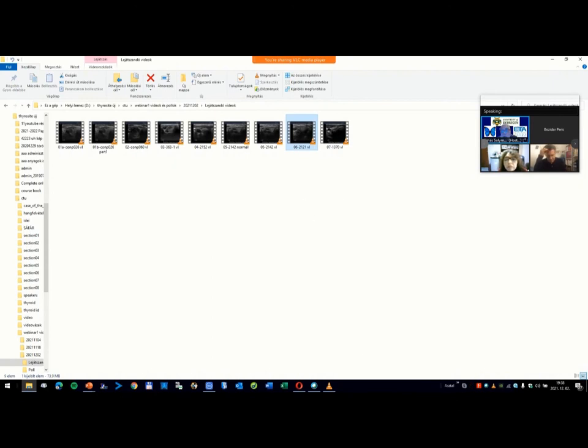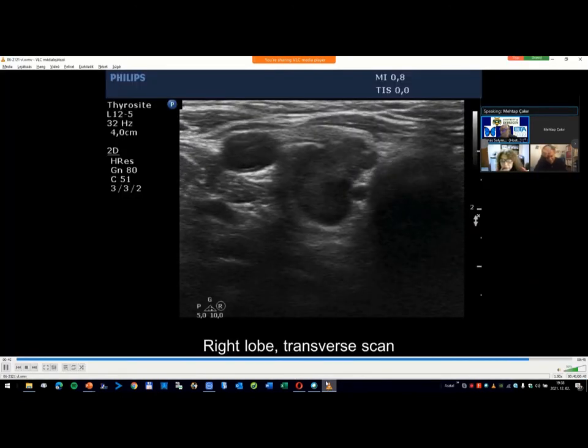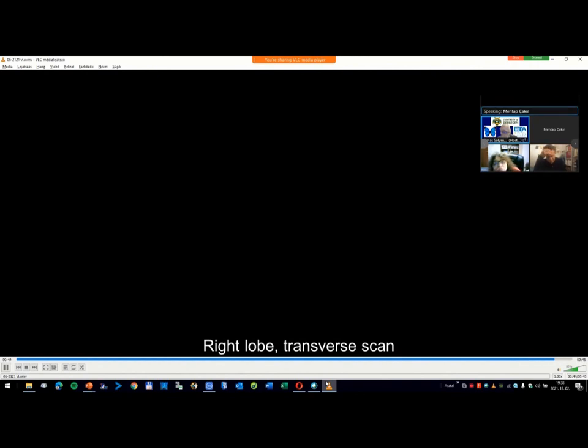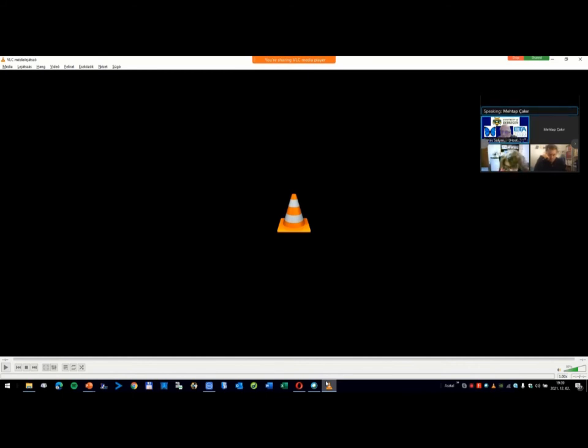Regarding the parathyroid lesion question: parathyroid adenomas may be located within the thyroid — this is possible. Regarding parathyroid carcinoma: as parathyroid carcinomas are neuroendocrine tumors, they present with metastasis rather than as invasive lesions. So seeing a speculated, invasive-appearing lesion like this does not imply parathyroid carcinoma.